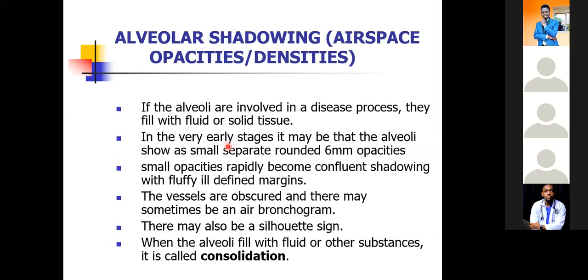And in the very early stages, it may be that the alveoli show as small, separate, round opacities.